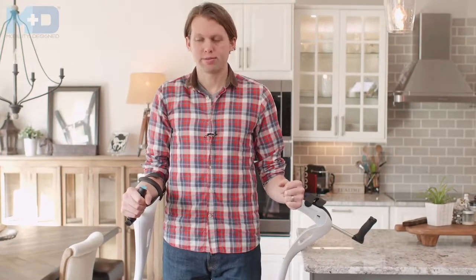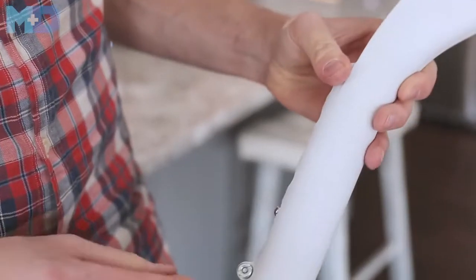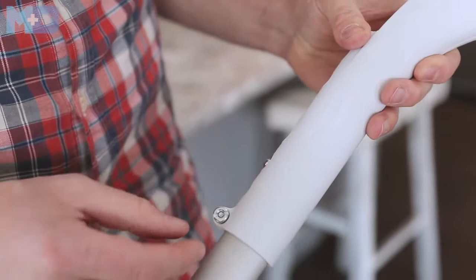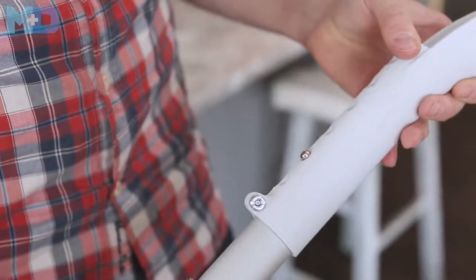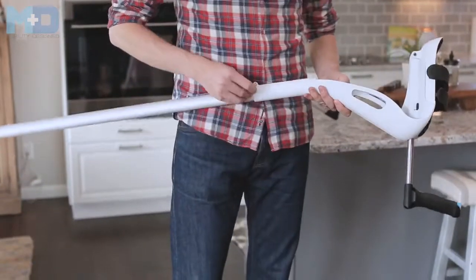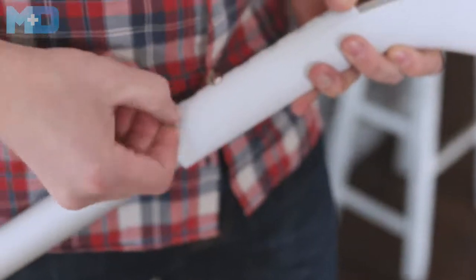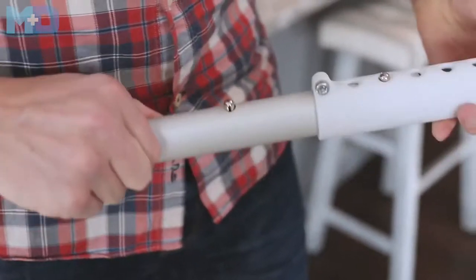That's about right. When you get it to the right height, you want to tighten the tensioner to reduce the noise of the leg. Right now, before you tighten it, it makes a little bit of noise. And afterwards, when you use a coin or a screwdriver, nice and snug until the noise is reduced.